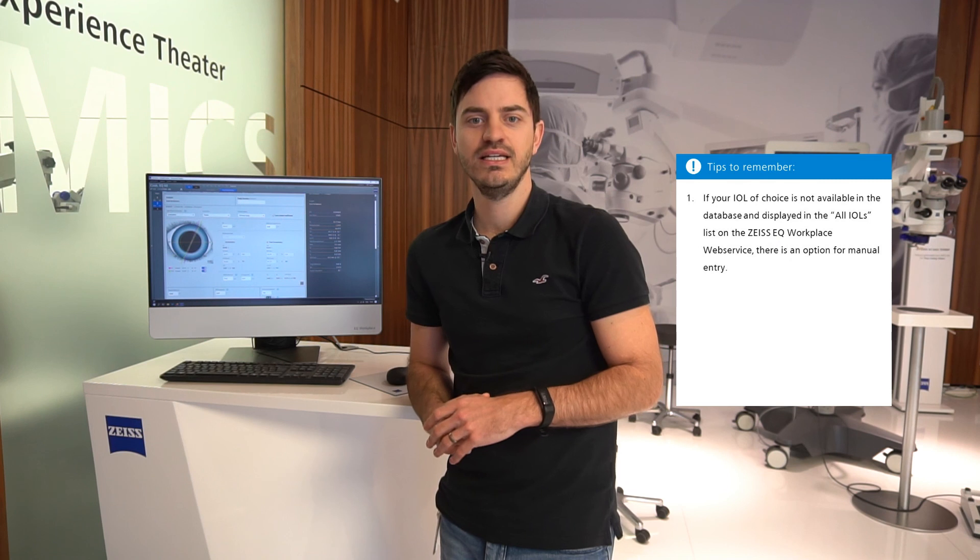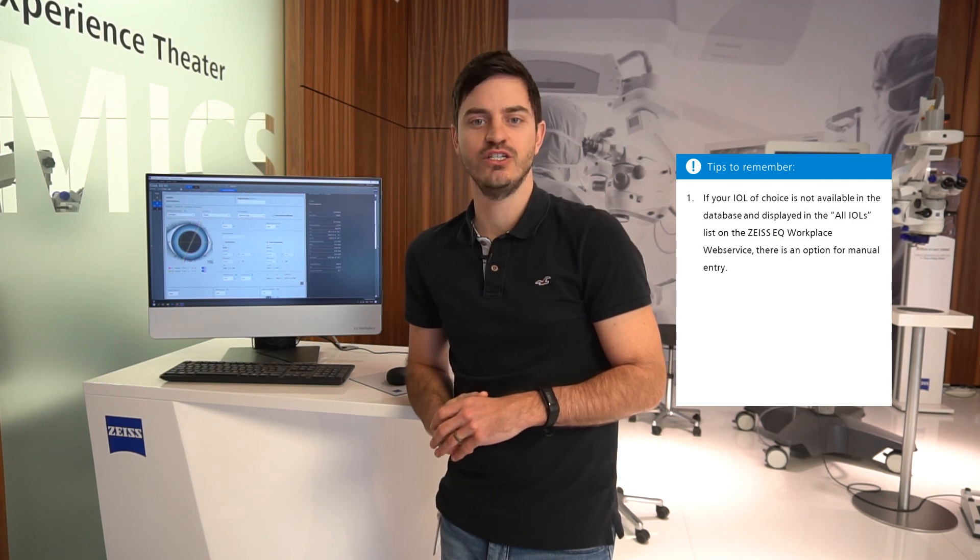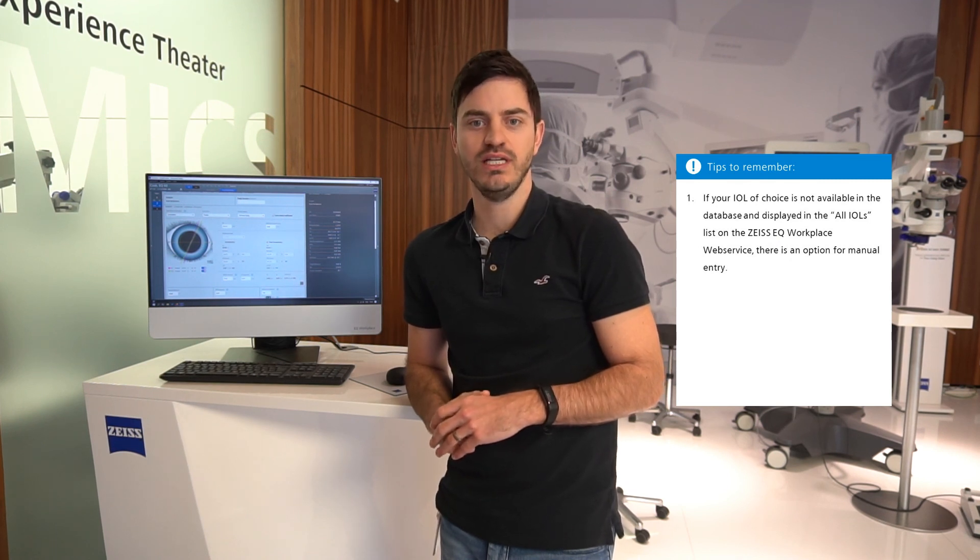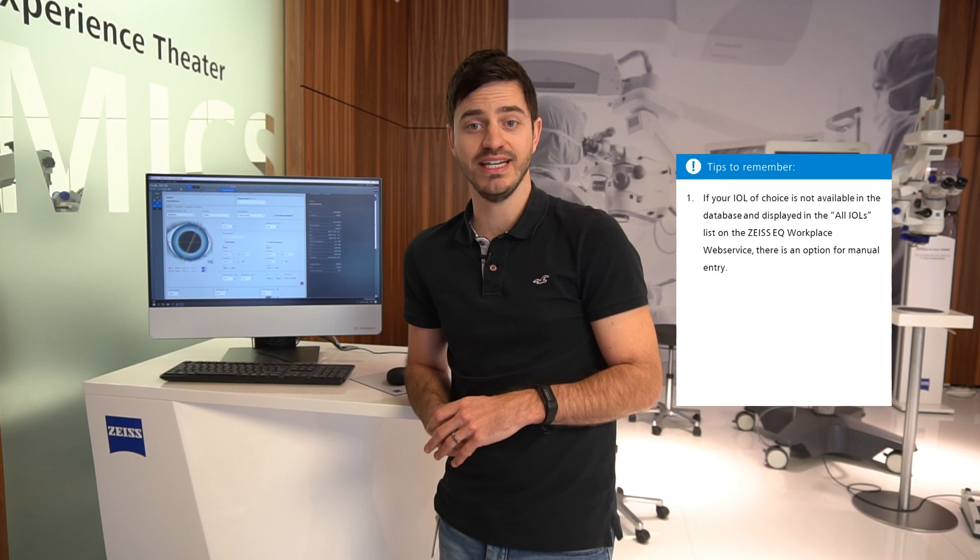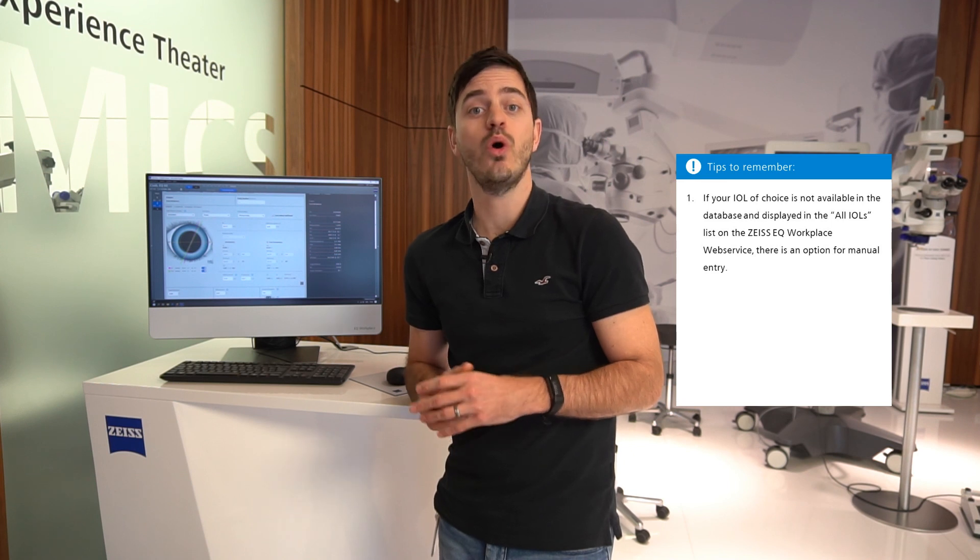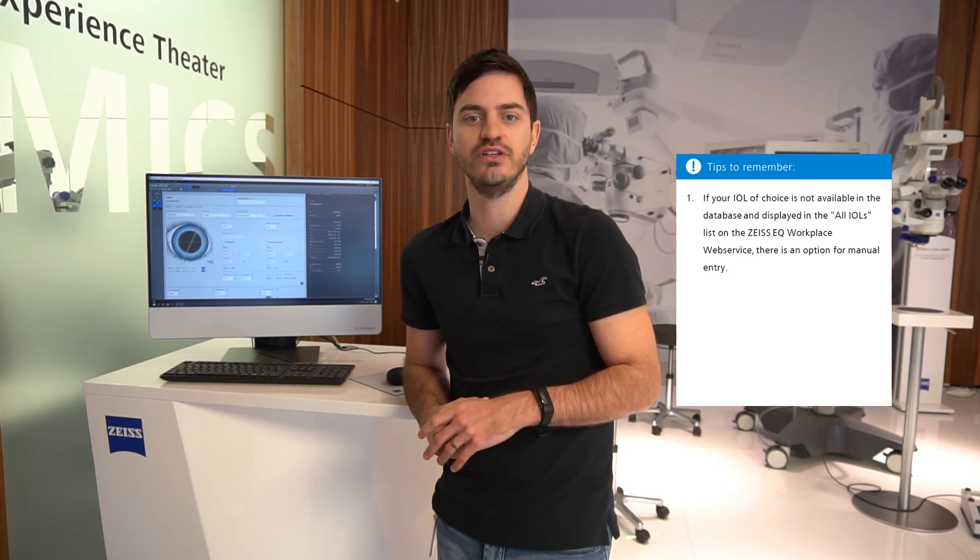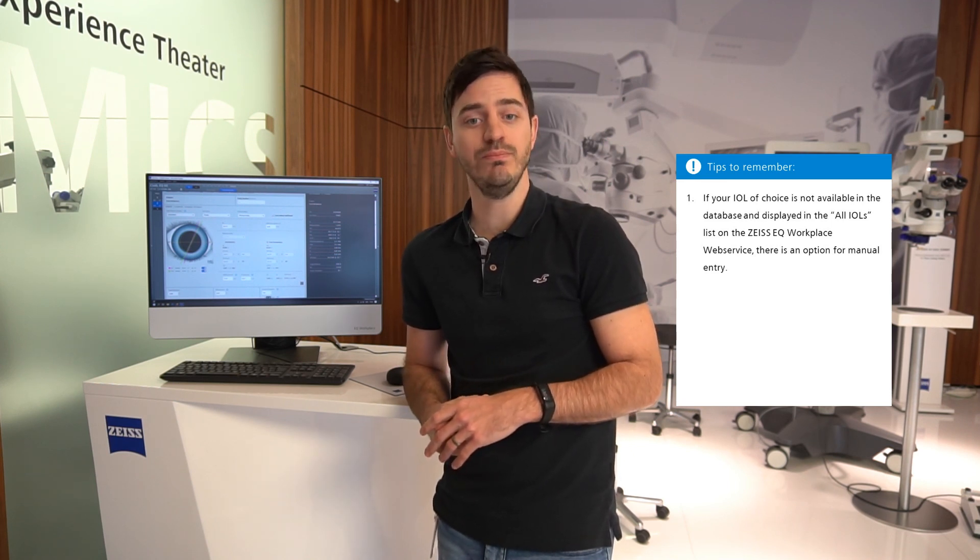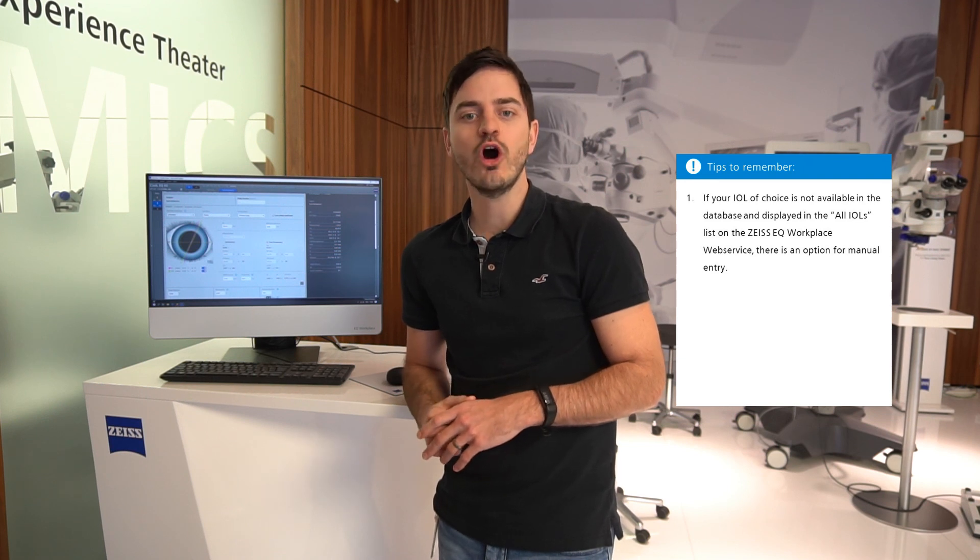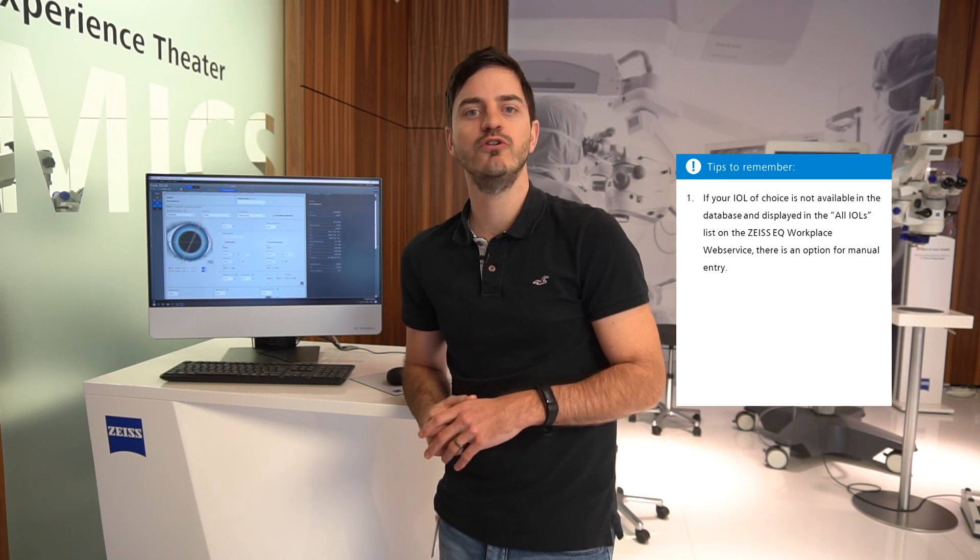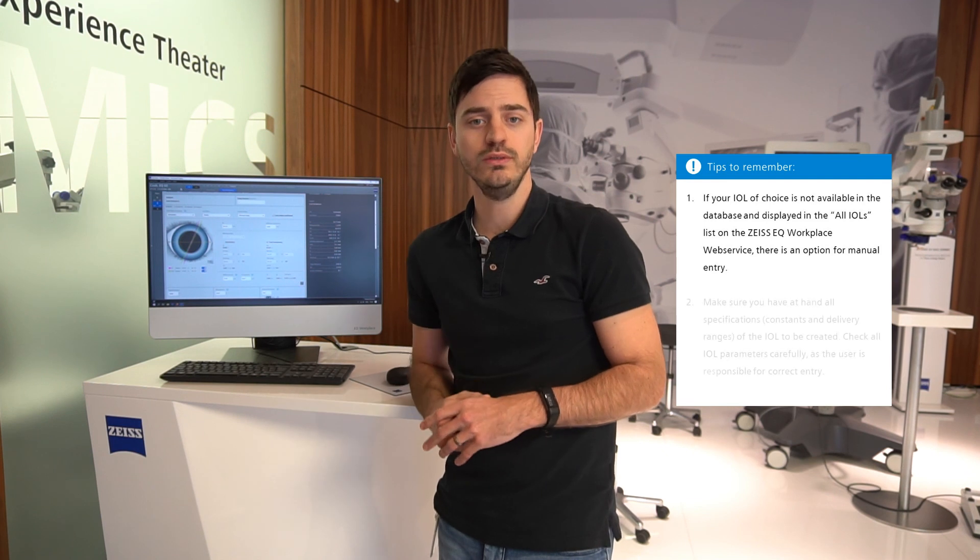One, if your IOL of choice is not available in the database and displayed in the All IOLs list on the Zeiss EQ Workplace web service, there is an option for manual entry.